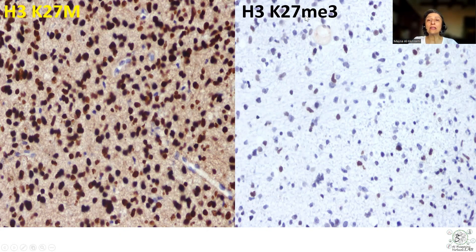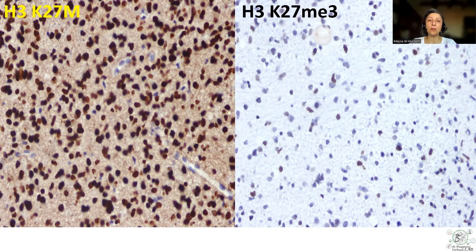Whereas the H3K27ME3, the trimethylation, the altered status would be interpreted by the presence of negative or weak staining in the tumor cells, in the presence of a positive internal control. So they are essentially the complete opposite of each other. When both patterns are present, this is supportive or even diagnostic of diffuse midline glioma.